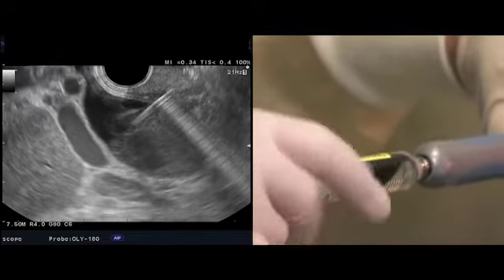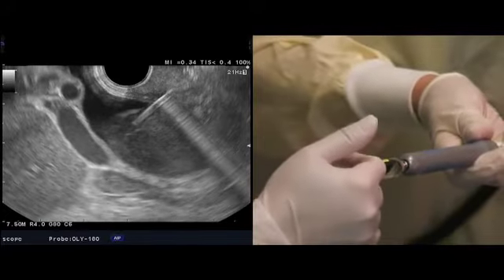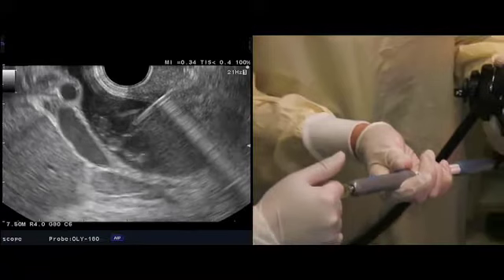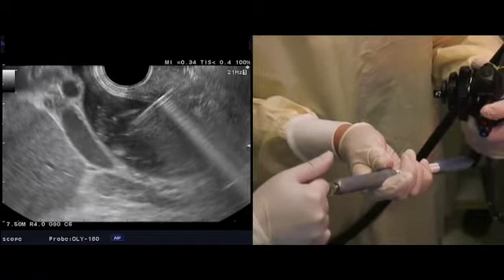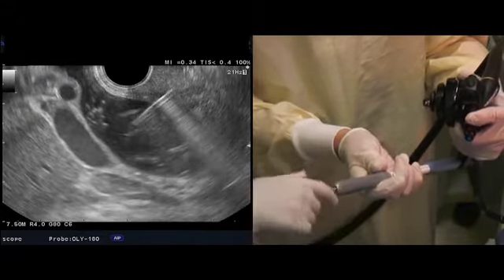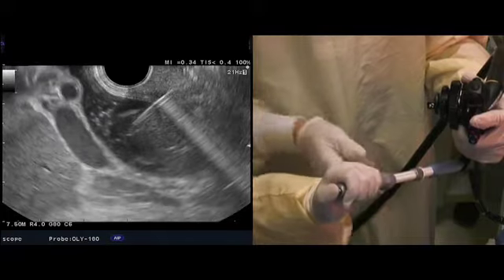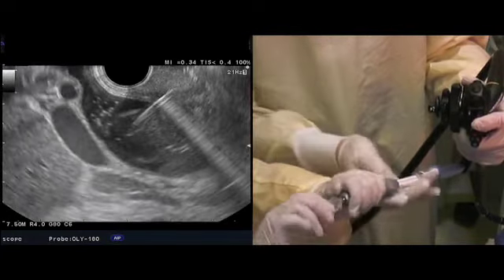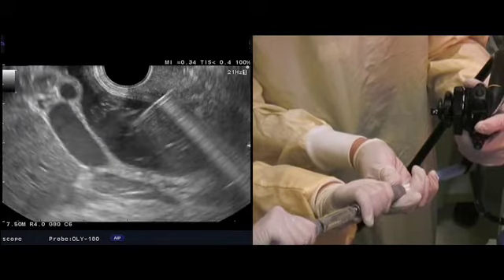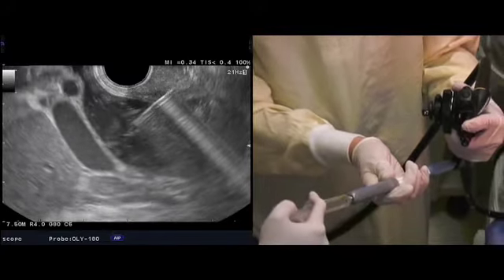Now let's inject some contrast — you'll see the contrast enter into the bile duct on the ultrasound image. Injecting. Let's get another contrast, please. Be careful not to put any air inside of the needle — aspirate first a little bit and then inject again. We want to avoid getting any air inside of our target structure.